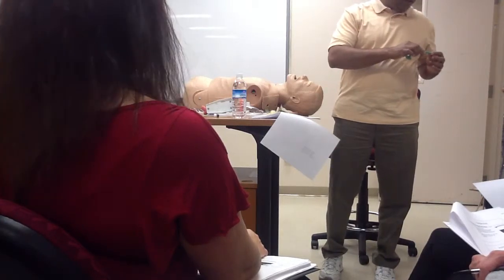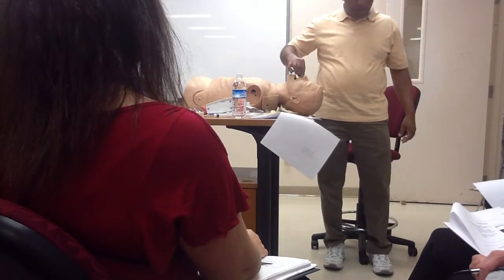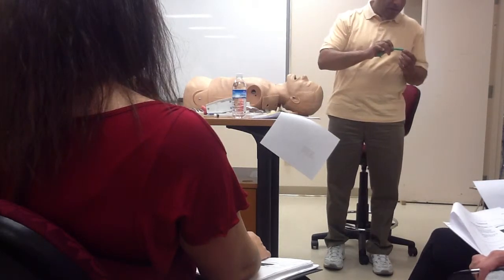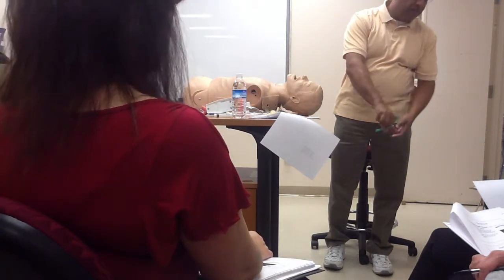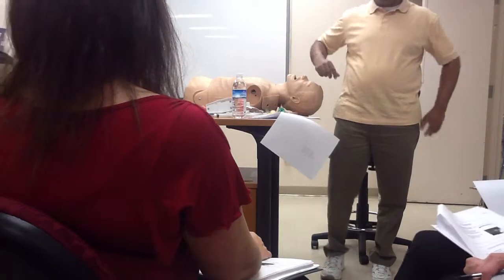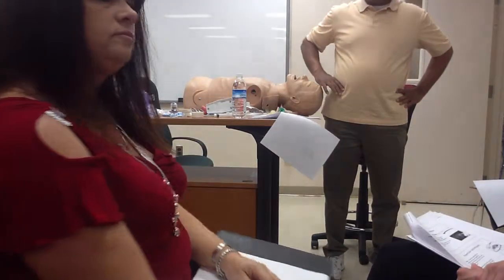In the hospital, what's the general thinking as far as how long they should stay in there? I mean, I always just put them in the outpatient, I'm never worried about it. In the hospital, only as long as they absolutely need it. If you're not suctioning them anymore, just put it on the one side, that way you don't use it. Okay, let's assume he needs it for 7 days. You change it every 24 hours.